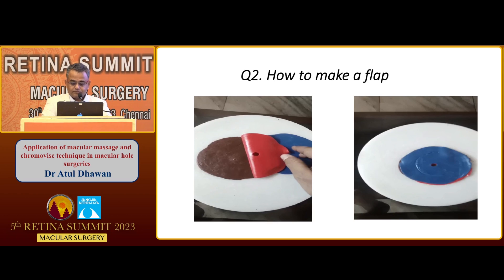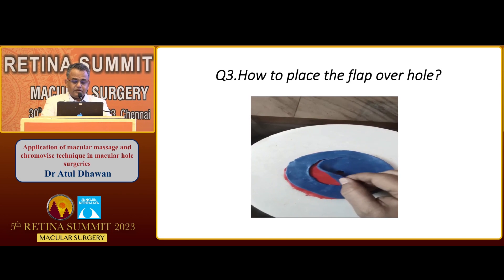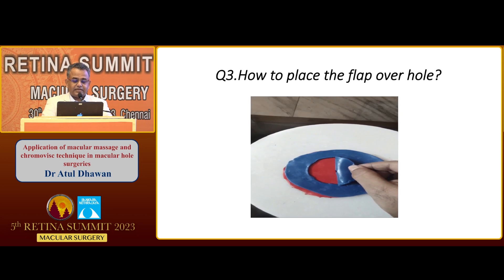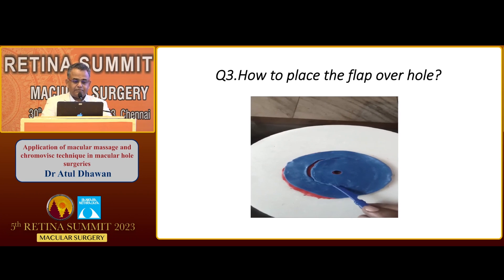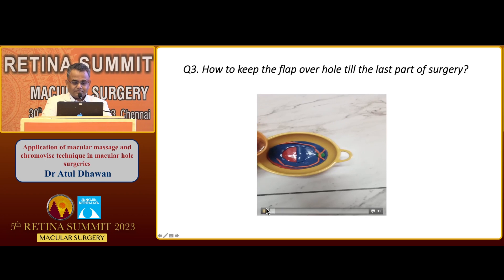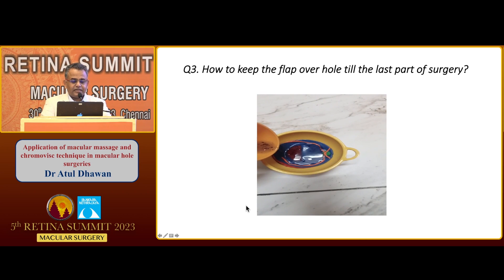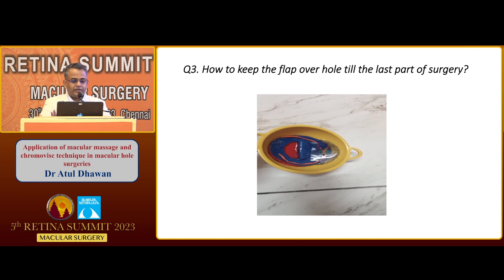How to place the flap over the hole? From one margin, take out the flap and place it from one side to the other very easily. The third question is how to keep the flap over the hole till the end of surgery. Place a temporary viscoelastic — temporary tamponade by viscoelastic colored with brilliant blue or any other dye. Then tilt the eye toward the disc, do the fluid-air exchange, and the flap will remain over the hole till the end of surgery.